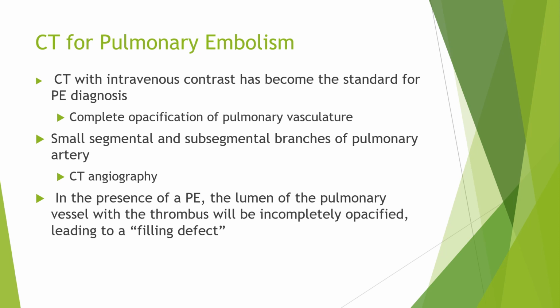And so this is where we're going into all these different things. CT with IV contrast has become the standard for pulmonary embolism diagnosis. Now, the board exams will still ask you about VQ scan, and we'll talk about that in here as well. But this spiral CT with contrast is going to be one of the bigger ones out there, and it's a lot better, because then you can see if it's not a PE, what could it be?